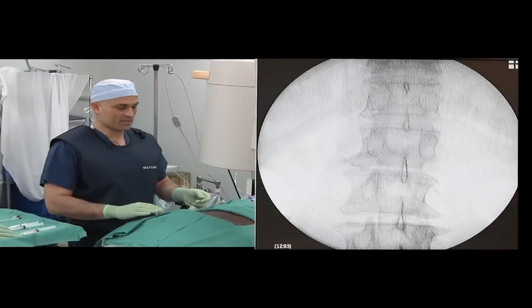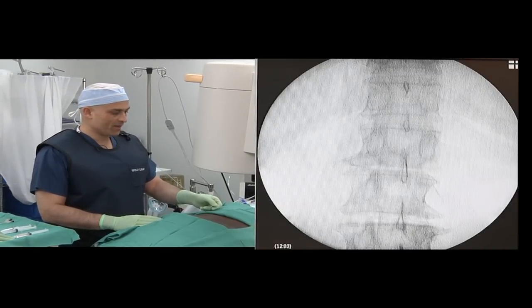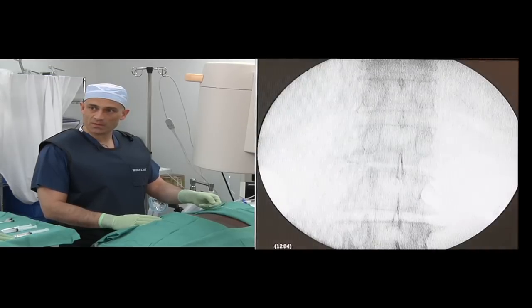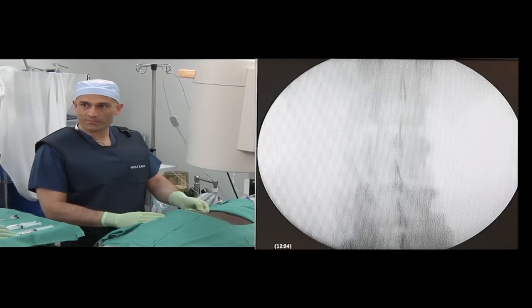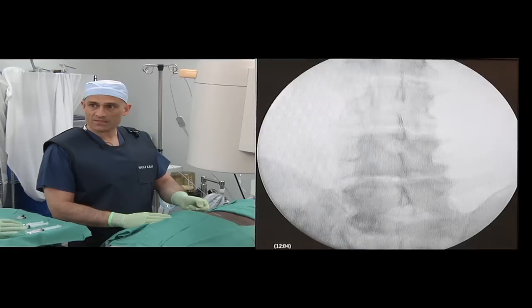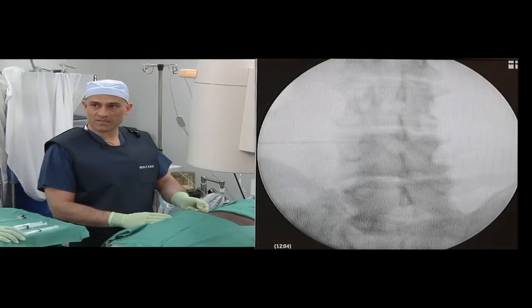The procedure commences with the identification of the correct lumbar levels, and we move the C-arm to the T12 level, and we count down from T12: T12, L1, L2, L3. The L3-4 facet on the left side is identified by the presence of the needle tip.